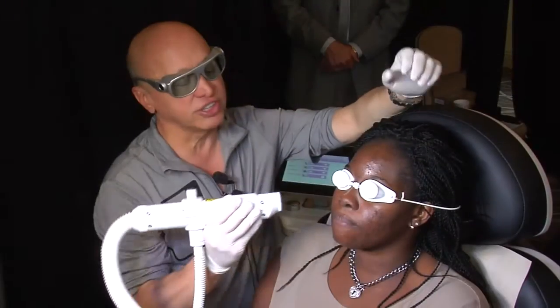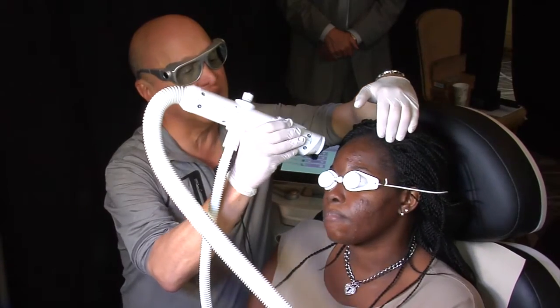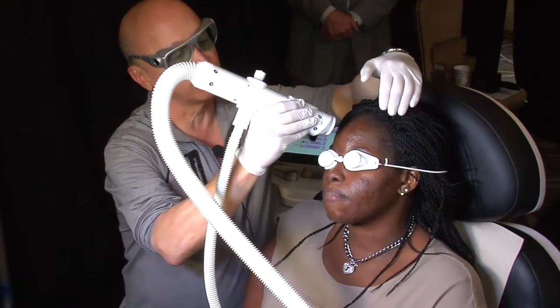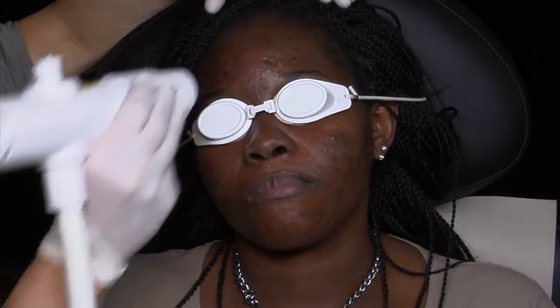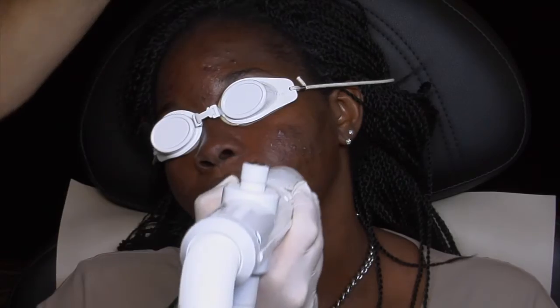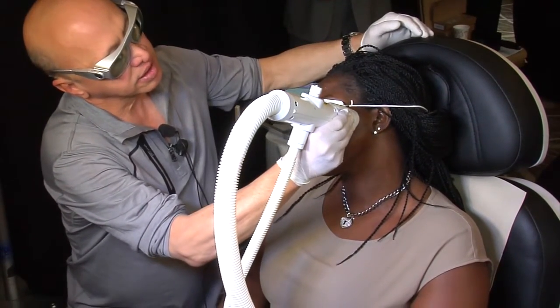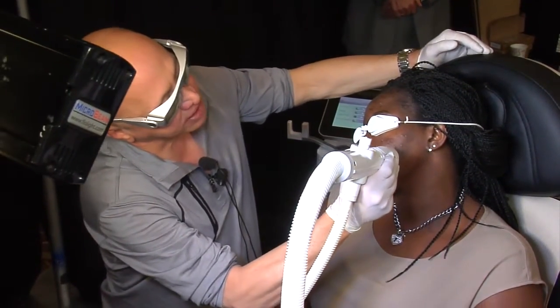I treat not just the area where there are lesions, but the whole face, because I'm trying to improve what she has, but I'm also trying to lessen the onset of other lesions. What I'll tend to do is go over the whole face a couple of times, and then go back and focus in on isolated spots.